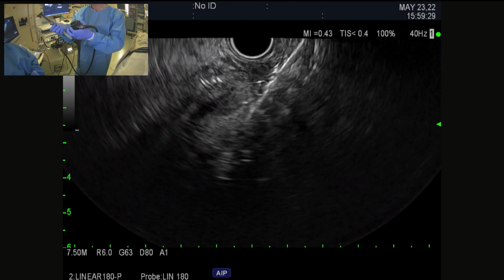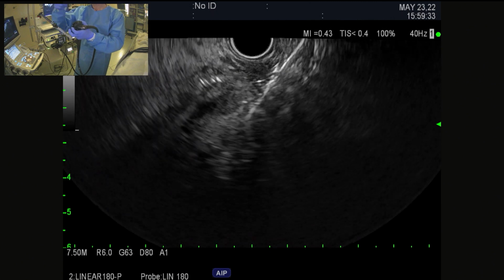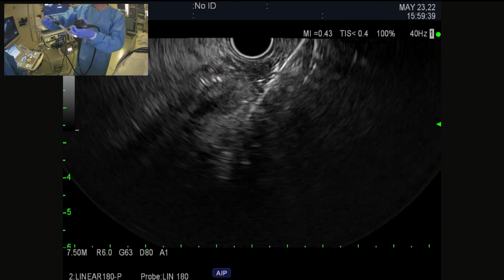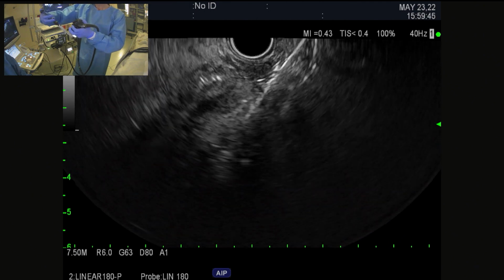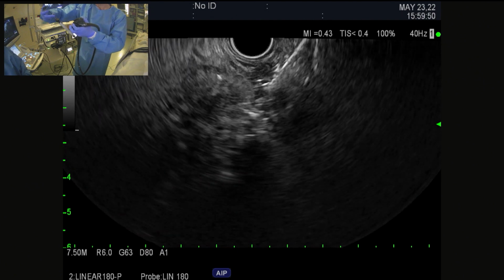And now I'm ready to take off the safety pin. That's this yellow pin here, throwing that off. And now I'm ready to deploy the distal flange. So I unlock the gray hub. You can even see the numbers. So now I'm going up to number 2, and I'm pulling up. As I pull up, we're going to see the distal flange deploy.